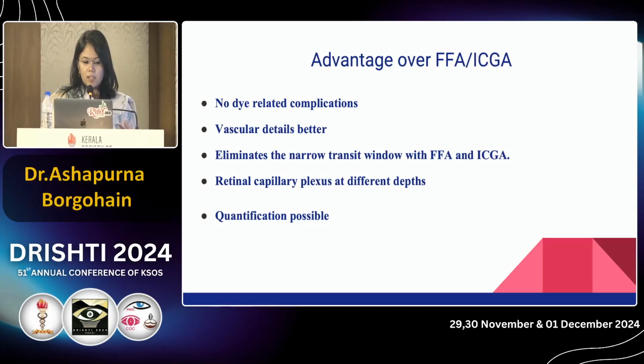It can image the retinal capillary plexus at different levels. No other modality can do that. And it also helps in quantification of certain parameters.